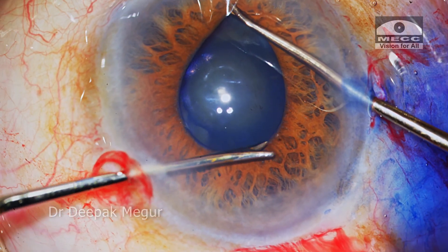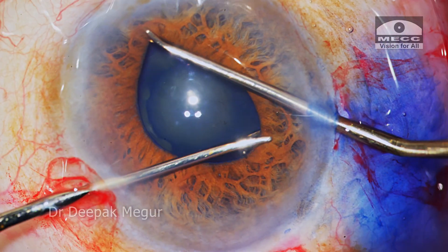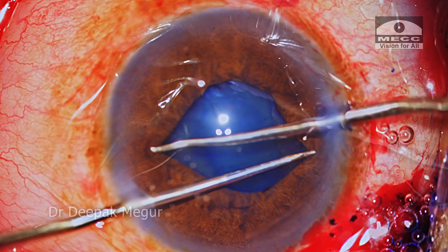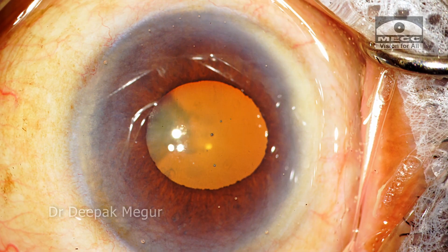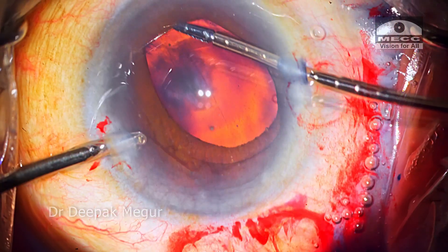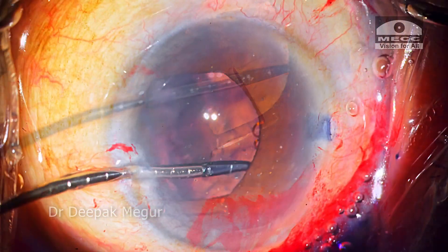When we plan to use a pupil-based ring device like the BX ring, we sometimes pre-stretch the pupil before using this device so that we get better pupil expansion and it is relatively easy to engage the device. Pre-stretching is beneficial for rigid pupils, especially in eyes with exfoliation. On the contrary, pre-stretching can be counterproductive in eyes with elastic pupils, especially those vulnerable to IFIS, because stretching worsens the floppiness of the iris. Hence we are better off using the BX device directly without pre-stretching the pupil.